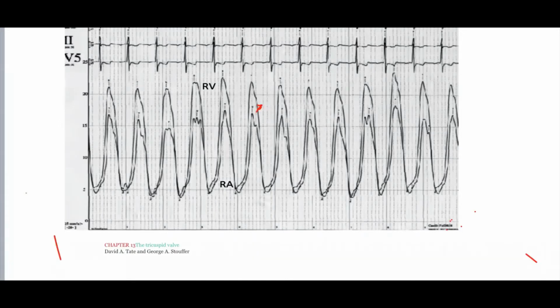So this is tricuspid regurgitation leading to a giant V wave. Sometimes they call it ventricularization of the V wave because it's close to the RV. So it's kind of ventricularized. Okay. So this is severe tricuspid regurgitation. Okay. Now what is this here?